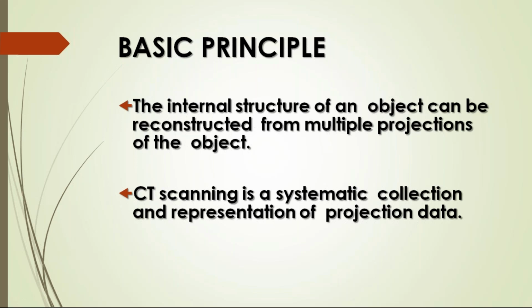The basic principle of CT is that the internal structure of an object can be reconstructed from multiple projections of the object. Okay, CT scanning is a systematic collection and representation of projection data.